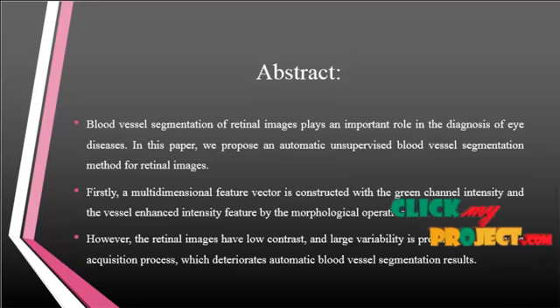This paper presents a robust and fully automated approach for retinal vessel segmentation. We propose a new filter based on 2D frames in an orientation score, which functions in the Lie group domain of positions and orientations. By means of a wavelet-type transform, the 2D image is lifted to the 3D orientation score.